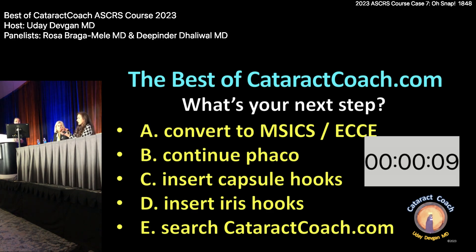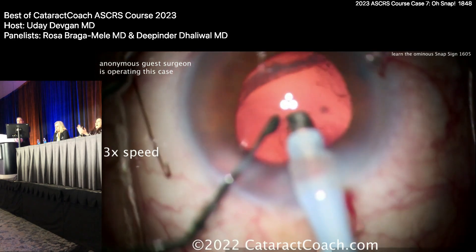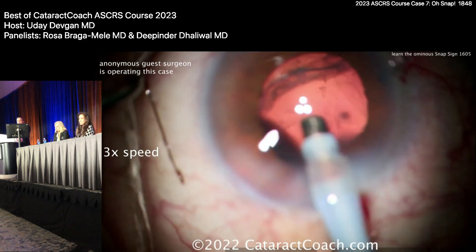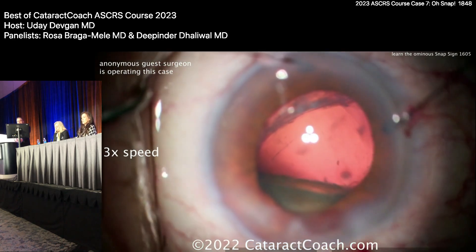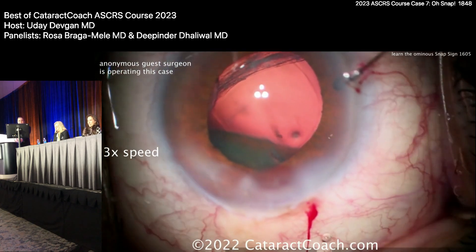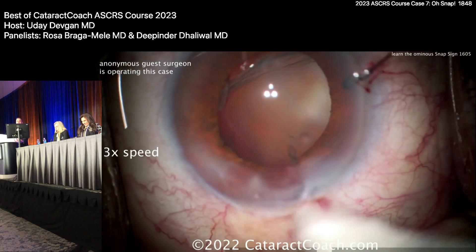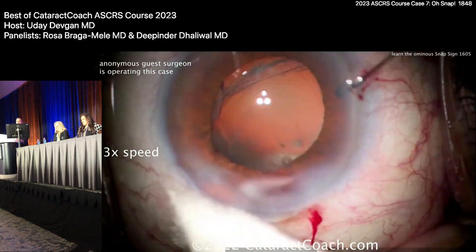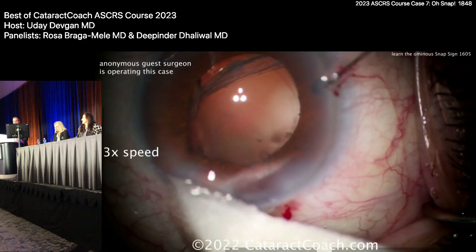The key is to be mindful of how deep the posterior capsule is getting, how much fluid entrapment there is, and remembering to let the fluid come around — just don't keep on injecting. Going back to the probe now — it looks really deep. Oh snap, again. Oh boy — there it is. Do you want to reach for it, fish for it? Yikes. The capsule is wide open, there it goes — let it go.